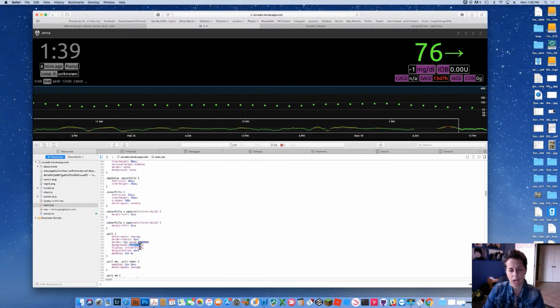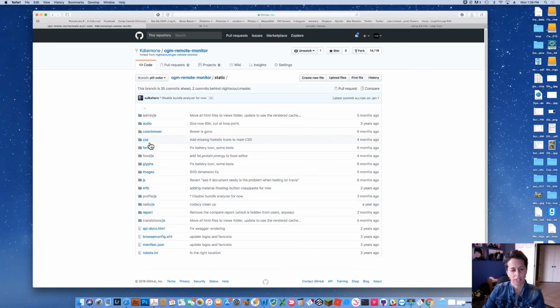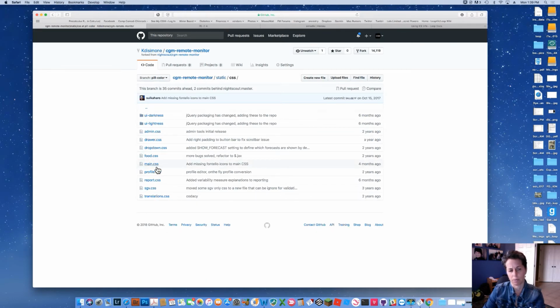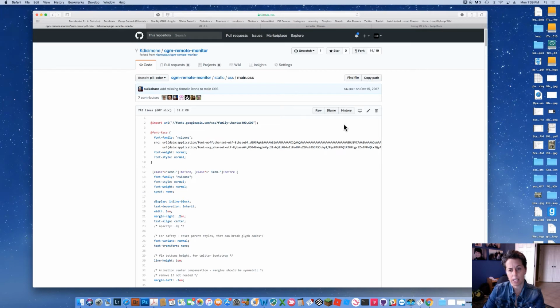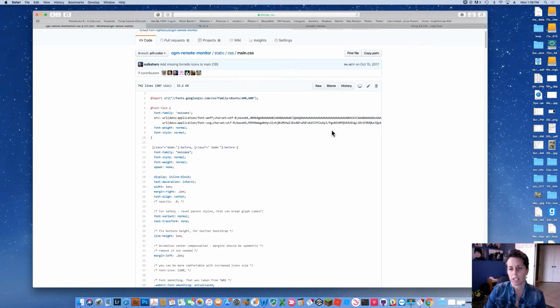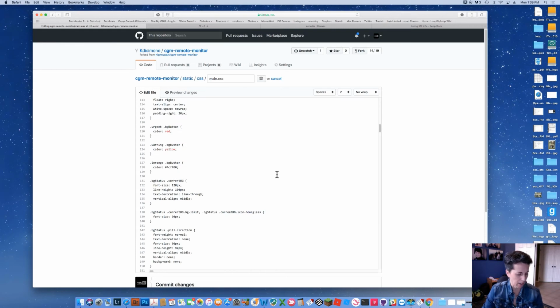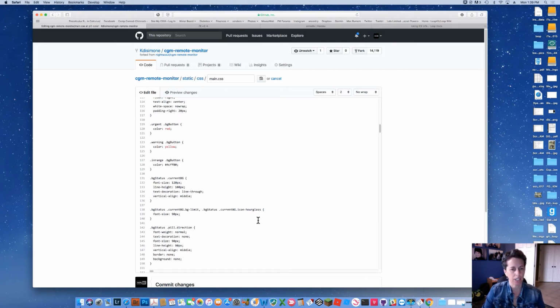You can copy that code and we're going to go to our actual Nightscout code and make that change. So we can go to, for example, the code for how your site looks, which is under static and usually it's a CSS, which is a style sheet. And we can go in here and I can find the page that lays out all of those style markers. So how big things are, what font, what color are all in here. I can click the pencil button to edit that file. And I can come down and find where that line was and make the change there.